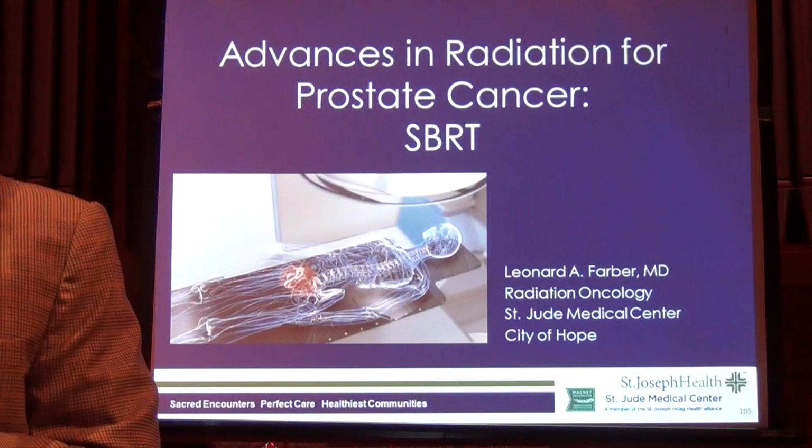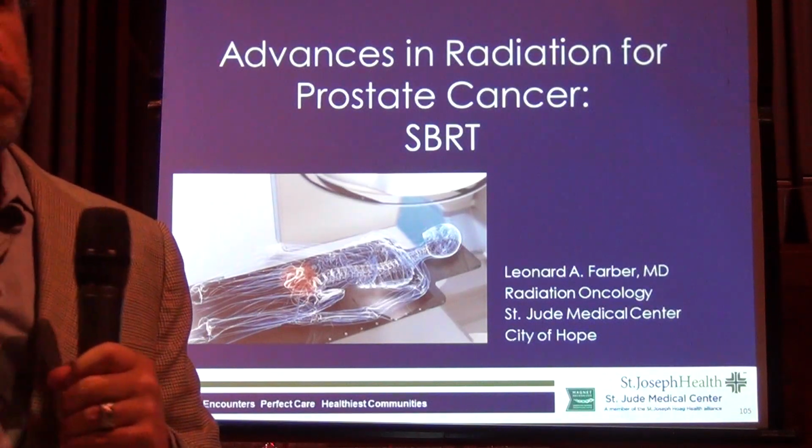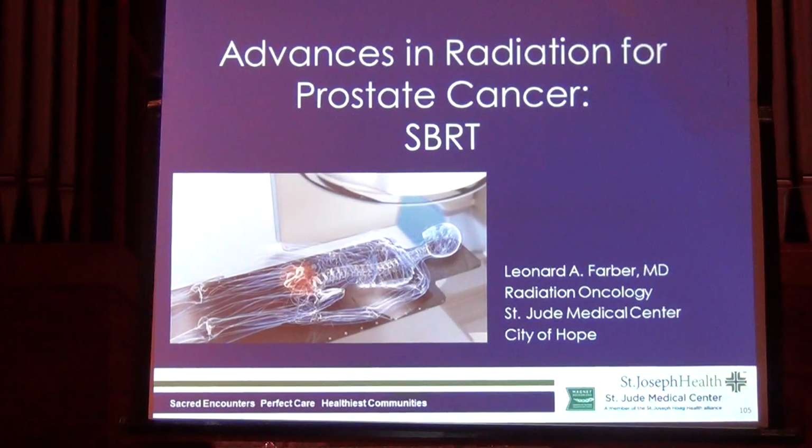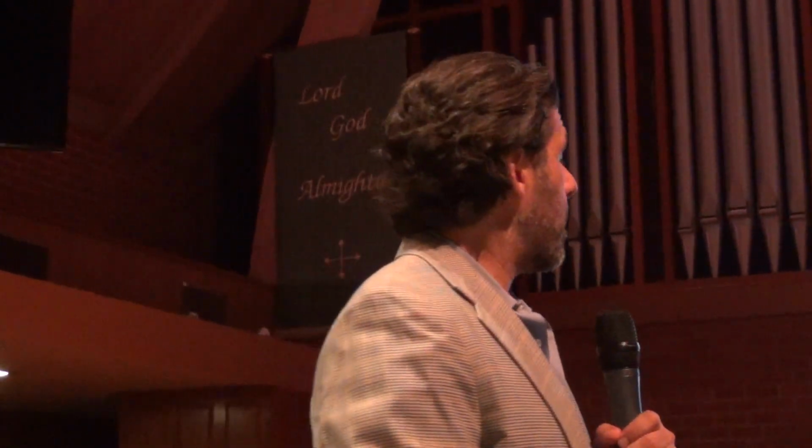What patients would you not do SBRT? So when I see patients, the first category that's a challenge is high-risk patients, and that's why we keep talking about low and intermediate. Although it's approved, it's not considered experimental, the high-risk long-term data do not exist yet. We have 5-year data that shows it's better than standard therapy, but we don't have long-term data. Does that mean I won't treat the patient? No. It means I have a discussion with the patient. The patient has an option to still get this treatment.